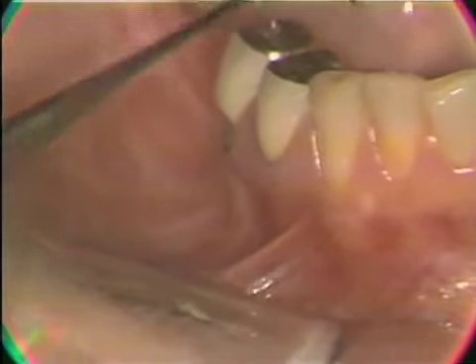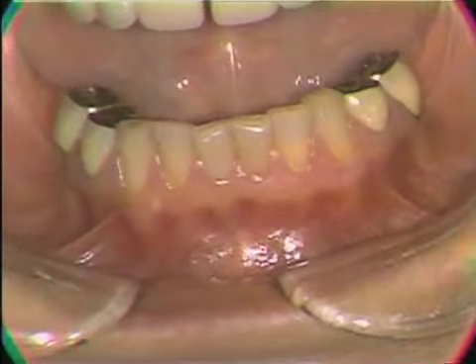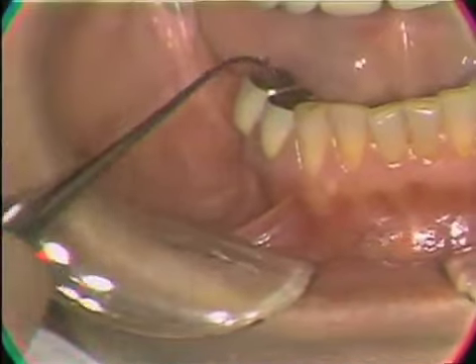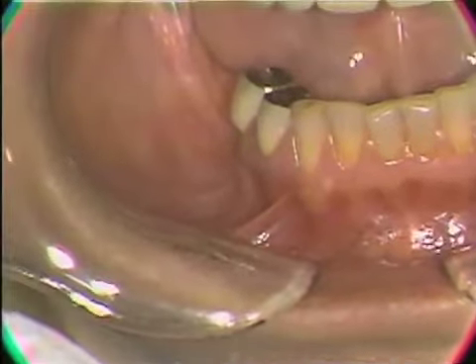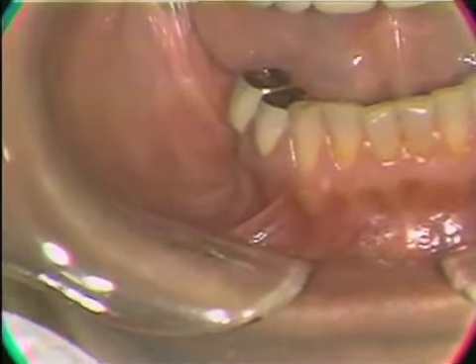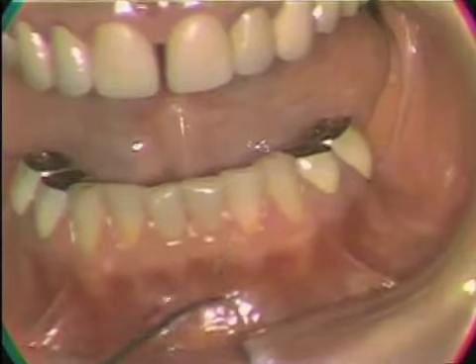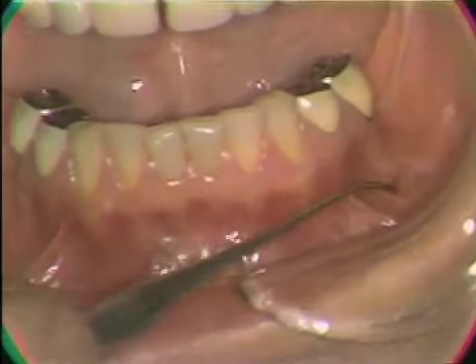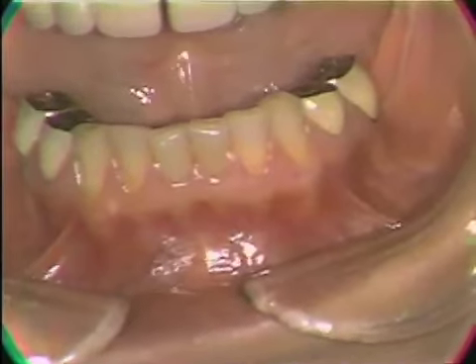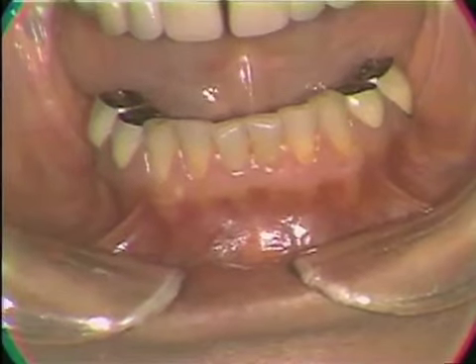Now, if the patient is allowed to sit without swallowing, you'll get a pooling of saliva in the ridge area, particularly in this patient. And that's why you would want to check the mouth, make sure there's no pools of saliva before you place the impression material. But the appearance of this tissue, as you see here, glistening appearance, little beads of saliva around the periphery, indicates that this patient is dried to about the right amount we would like.